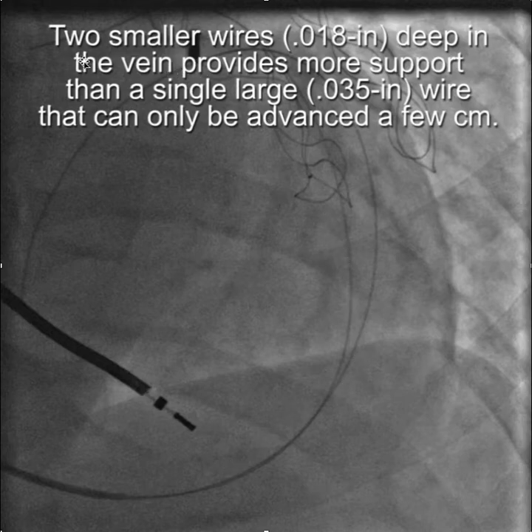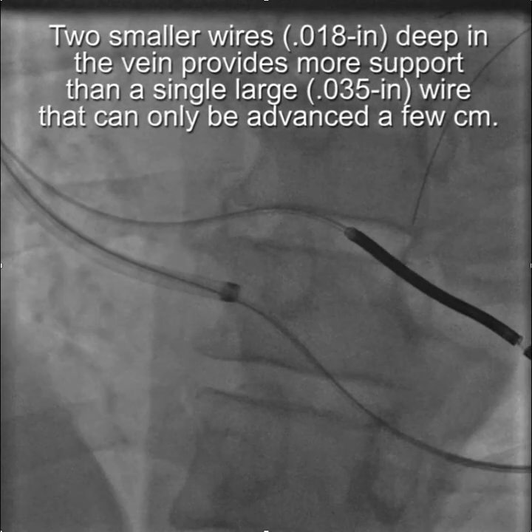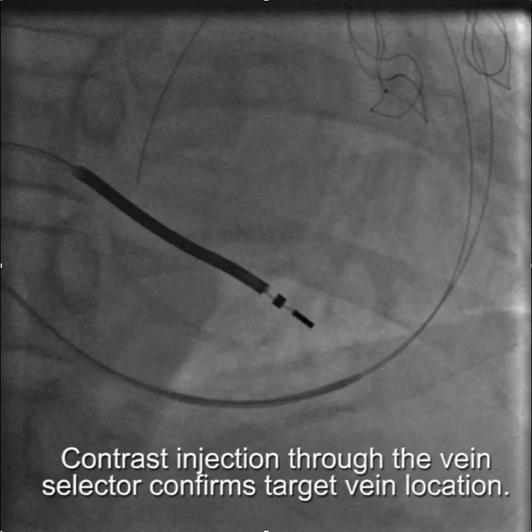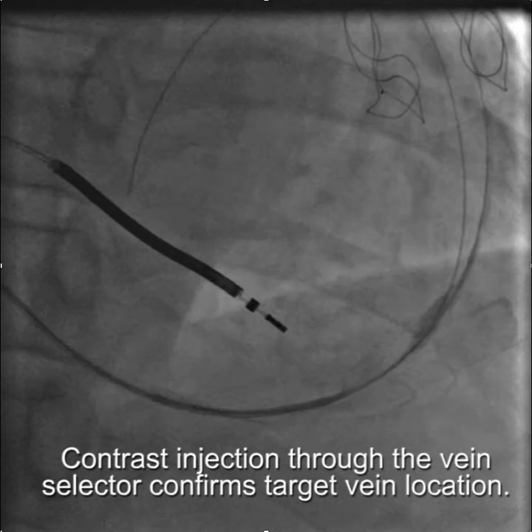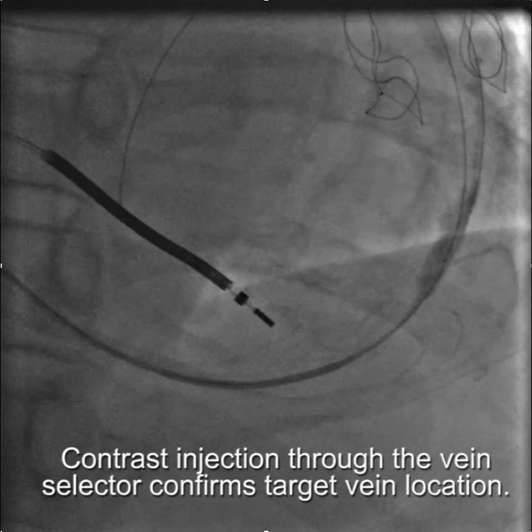And I think you'll learn that two smaller wires, in this case the .018 wires, deep in the vein provide a lot more support than a single large wire that can only be advanced a few centimeters. So we've stabilized the vein selector, and we injected contrast through the vein selector to determine what things look like. And you can see there's a branch here, and then this is the lateral wall branch that we're interested in putting the lead in.